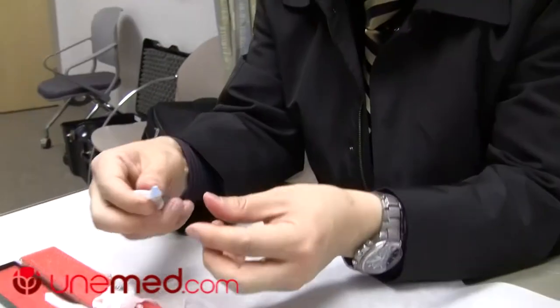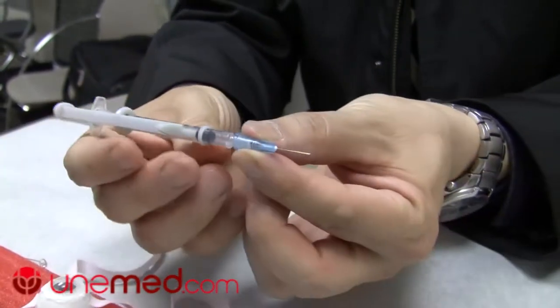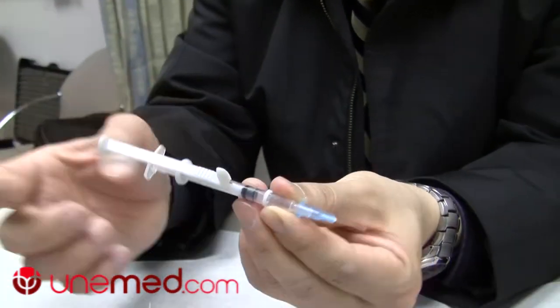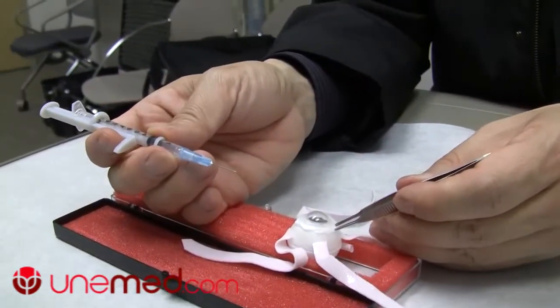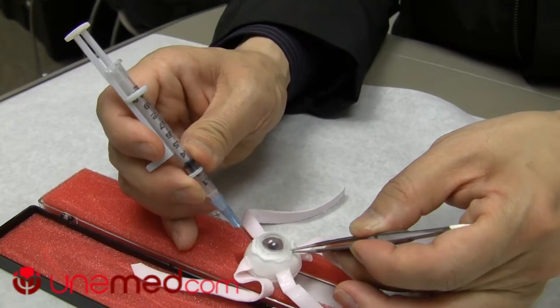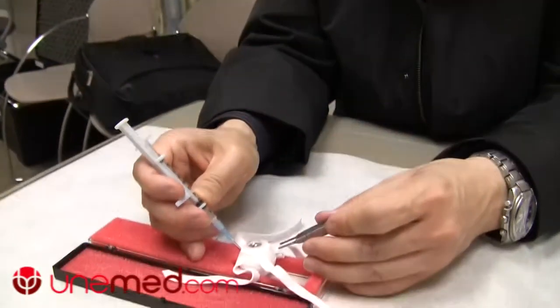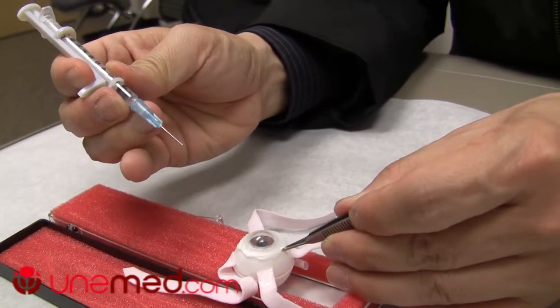So this is why we invented this syringe. It's a little different from the traditional syringe — it has a bevel ring that helps you control it so your finger doesn't accidentally slip. It also has a plunger that's attached to another bar with a finger rest and a groove situated right there. What we do is grab onto the eyeball, and because my fingers are in close proximity and I'm not extending any muscles, I can control the exact amount needed. You can also preset it to exactly how much you want to inject.